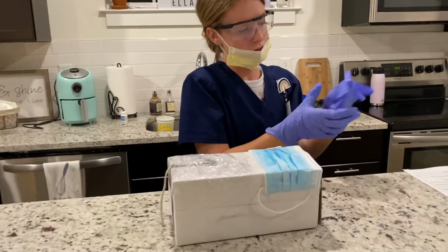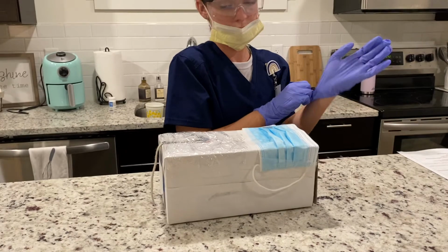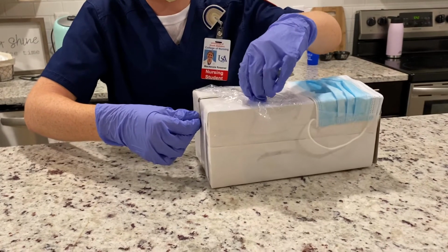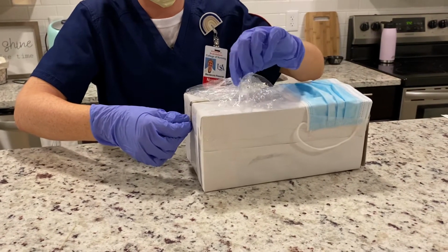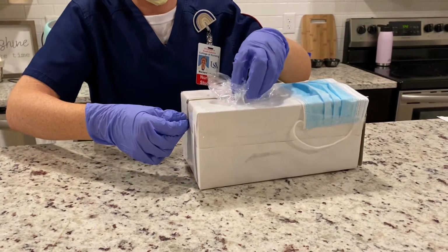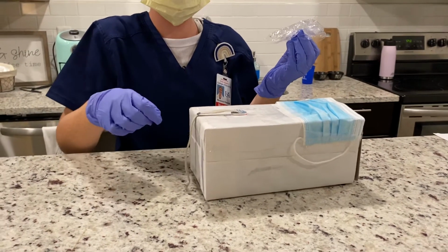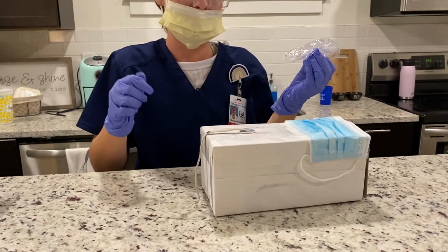And now I'm going to remove the dressing from the patient. I'm going to secure the catheter, and I'm going to pull the dressing towards the wound. And I'm going to assess the catheter, the insertion site, and the surrounding skin.